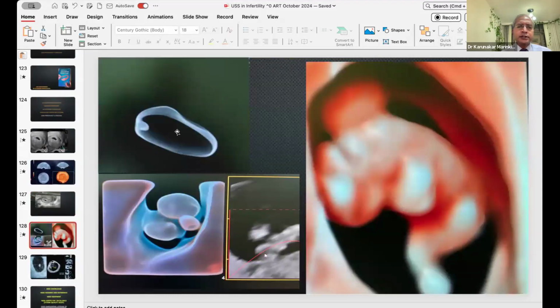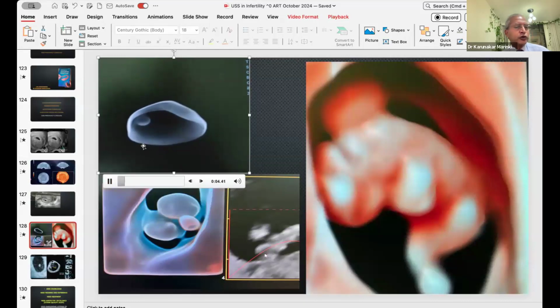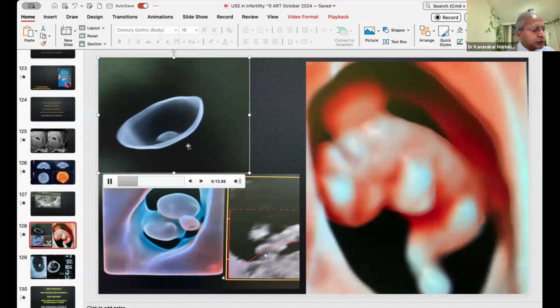There are many advantages. I'll just show one I fancy. That's a 5 weeks gestation sac and yolk sac. It's shocking to me. I recorded this in 2018. I have much more superior quality ones now. It looks like a jellyfish to me. This is the level of technology that we have.